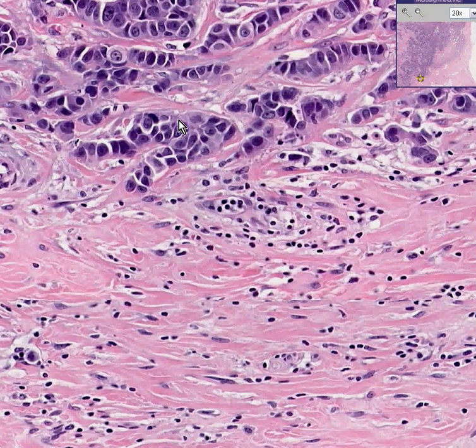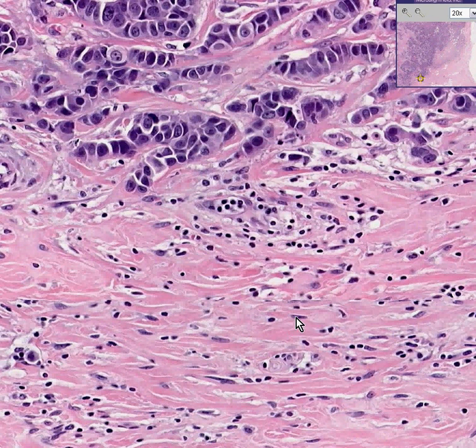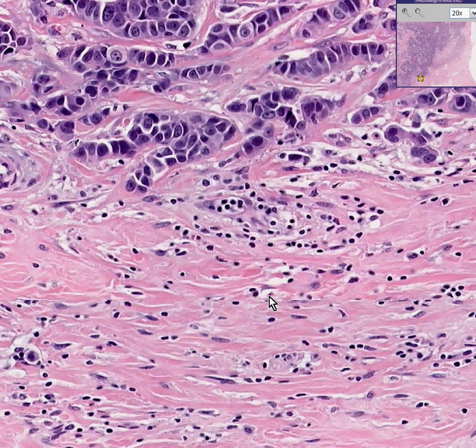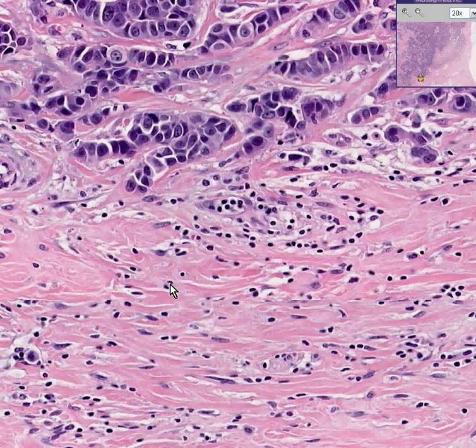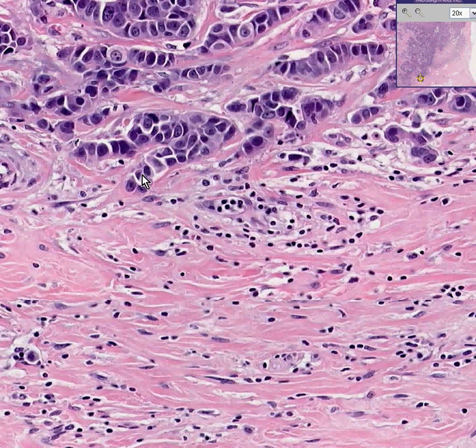In addition, all these little pinpoint cells out within the fibrous tissue — here's a fibroblast, here's a fibroblast — but the little round cells are just scattered nests of lymphocytes because, like most tumors, the body wants to fight it with its own immune system, i.e., lymphocytes. Generally speaking, the more lymphocytes that cuff or surround the tumor is often associated with a better prognosis than when these tumor cells just go out invading and there's no little soldiers out here to fight them.